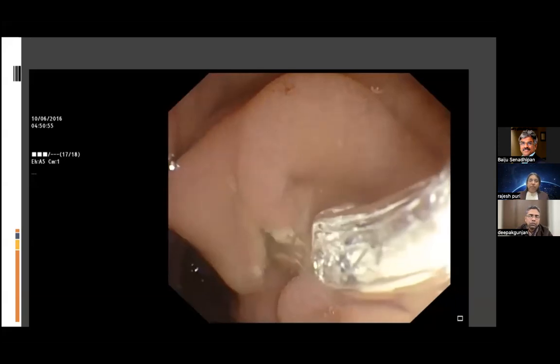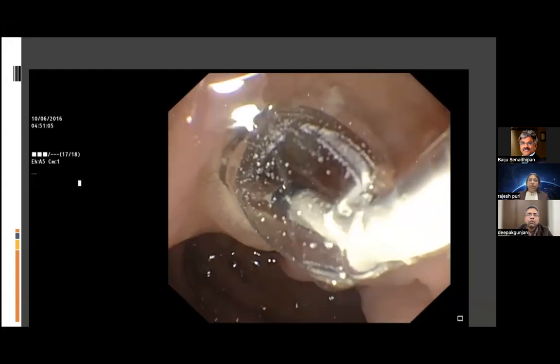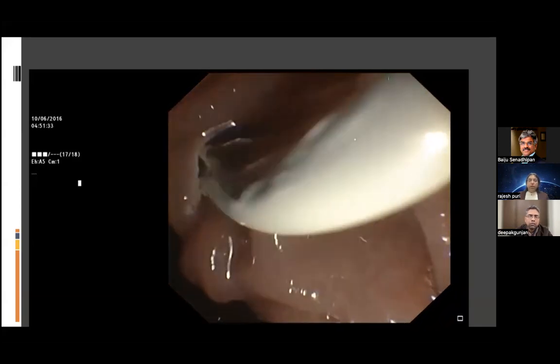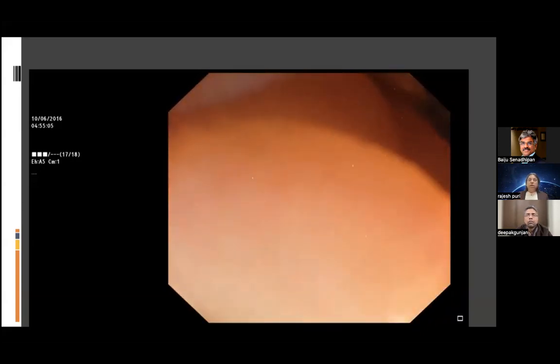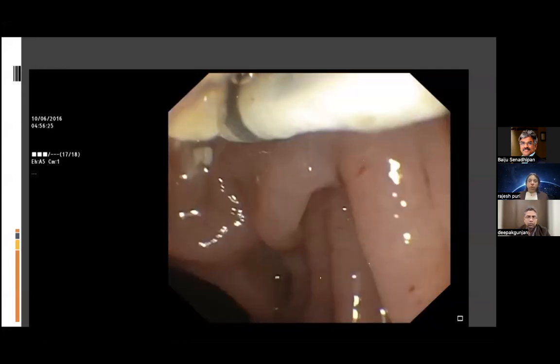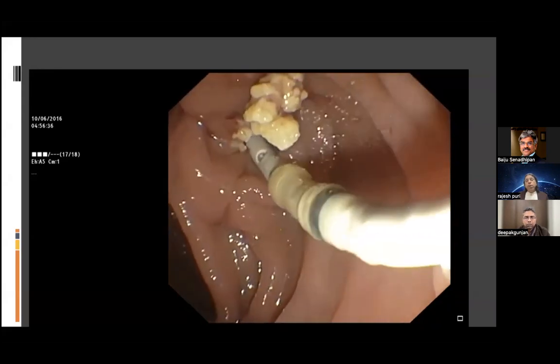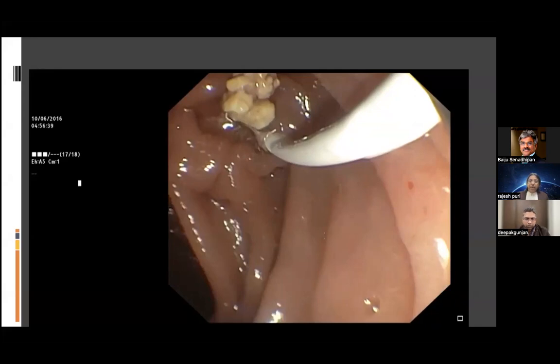As I said in the previous slide, what I do in my practice is I dilate the pancreatic orifice after the sphincterotomy with a 1 centimeter hurricane balloon, and a 6 to 7 millimeter pancreatic stone can very well be removed with this. So I think this is a good technique. That is like a balloon sphincteroplasty, what we were doing for the large CBD stone. We were dilating with a CRE balloon up to 15 or 18 millimeter. Here we dilate up to 1 centimeter, and a stone of 5 to 6 or 7 millimeter can be very well removed.